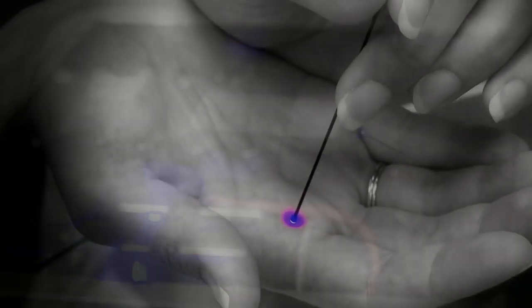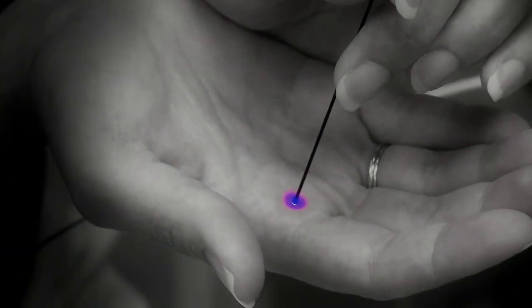With this technology, you can take this microscope and touch it right onto the suspicious area, and right at the point of care you can have a diagnosis with confidence that it is an accurate diagnosis and enable immediate outpatient therapy.